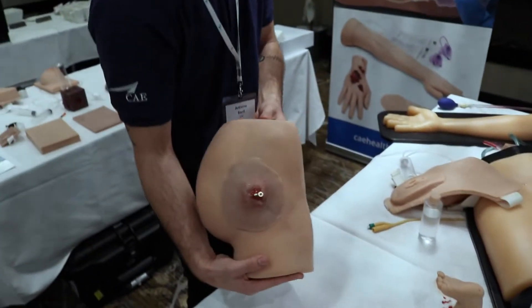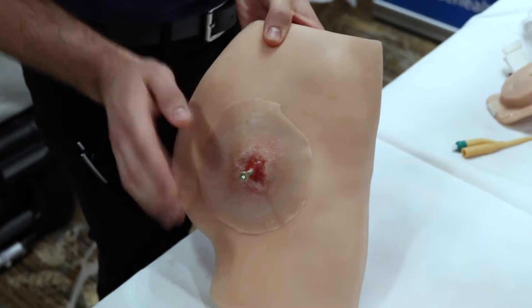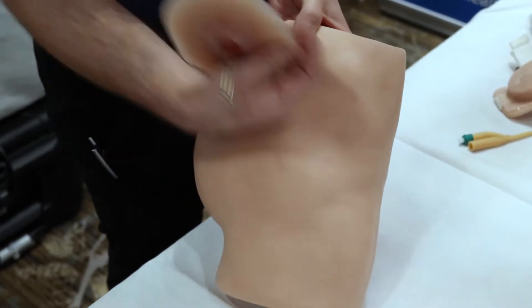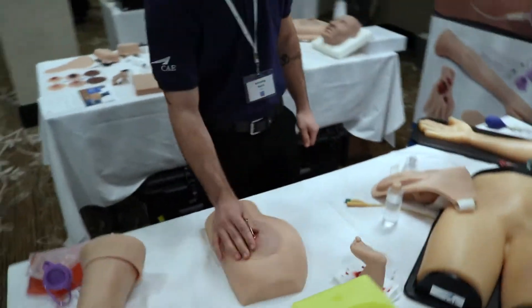We have our ventrogluteal injection site with bones, and on it right now there's a sticky wound that I can just peel right off without anything else left on this product.